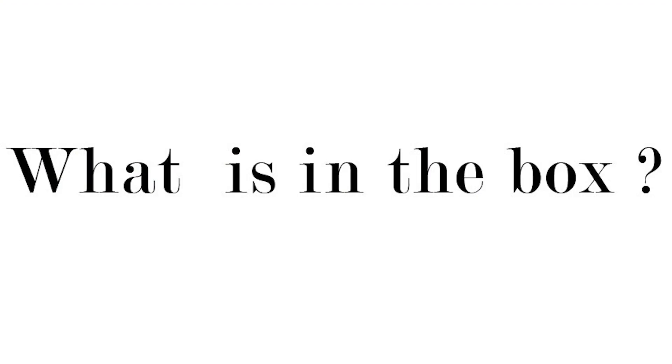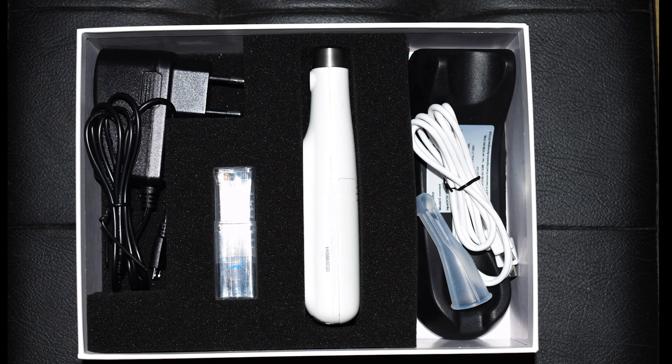Let me take you directly to the content of the box. As you can see the box contains one charger, one endomotor, one cable which connects the endomotor with the Epex Apex locator, and one stand.